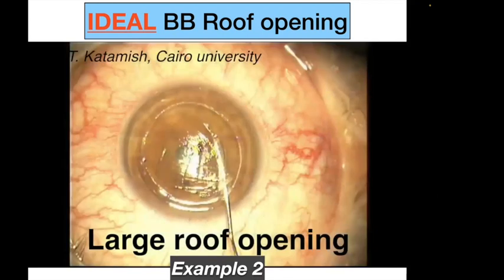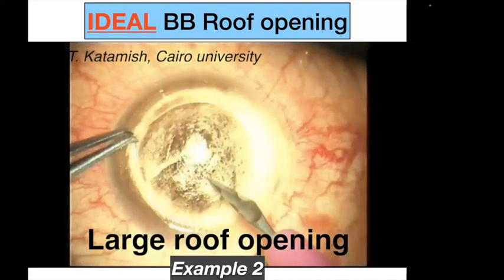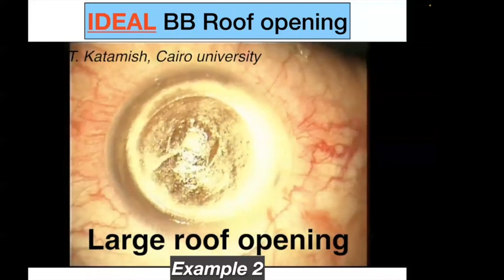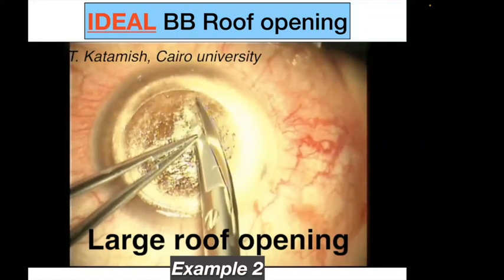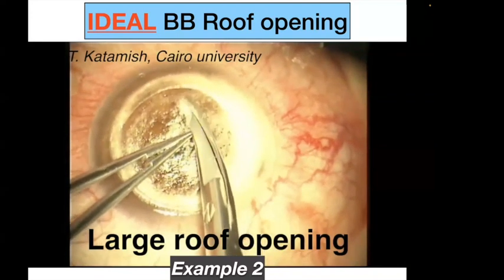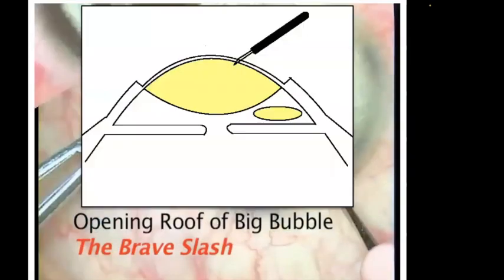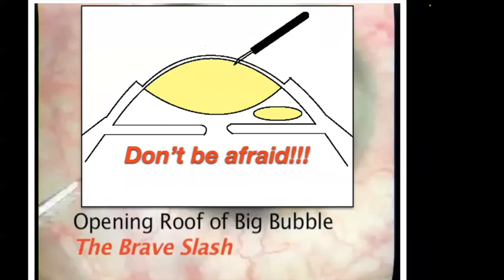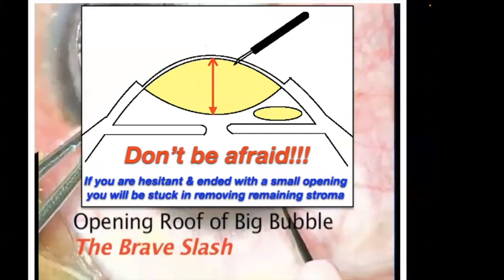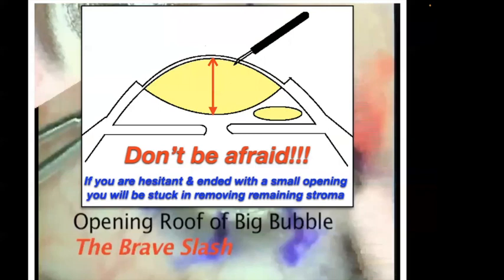Another example of ideal big bubble roof opening, big bubble type 1 again, and then this is a Brave slash with ideal size opening that you can introduce your scissors and continue your operation. If you have a minute opening, you will be stuck in this step. So this is a Brave slash, as I have mentioned. I always say, don't be afraid. The distance between the roof and floor is large, and if you are hesitant and end with a small opening, you will be stuck in removing remaining stroma.